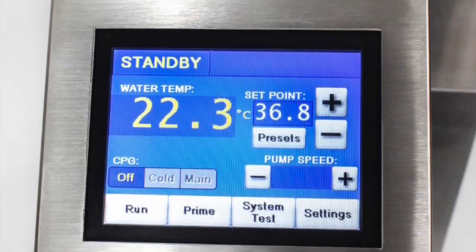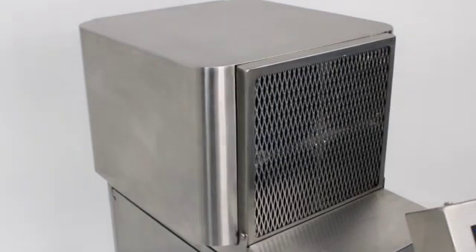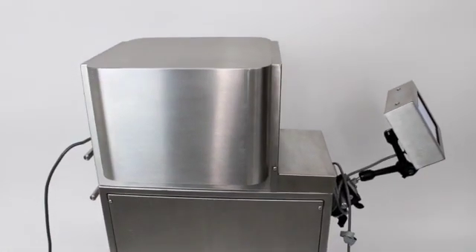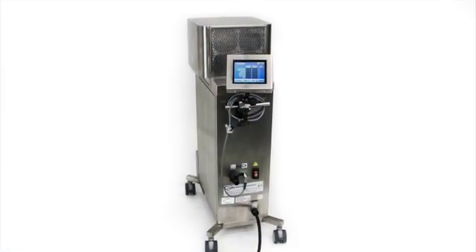The refrigeration module eliminates the need for loose ice, chills a tank of room temperature water to 3 degrees Celsius in approximately 60 minutes, with ice block formation in approximately 4 hours.